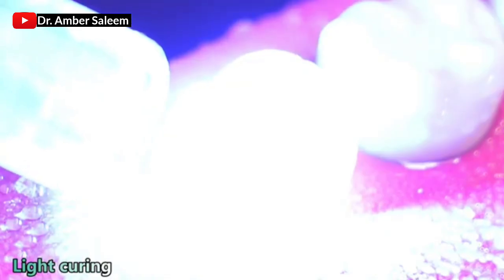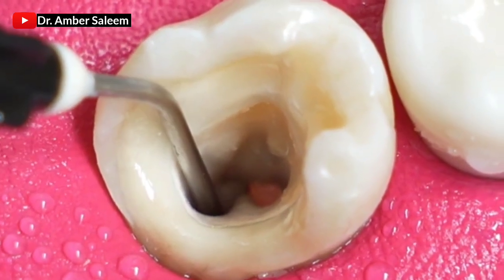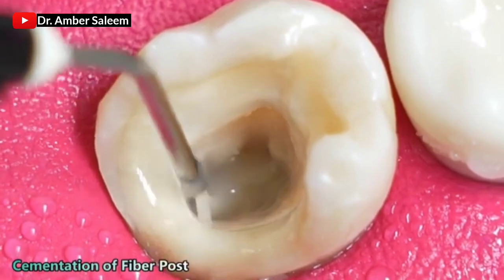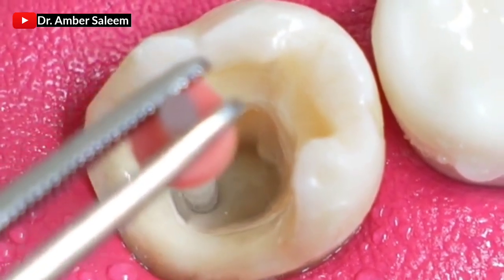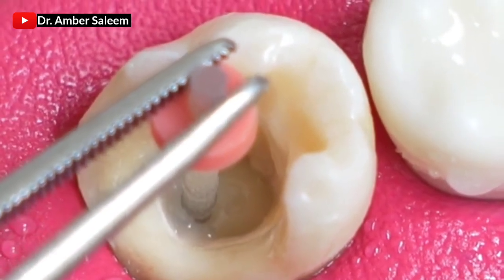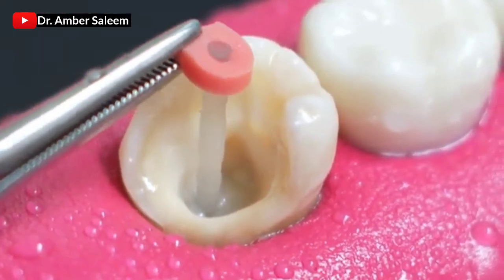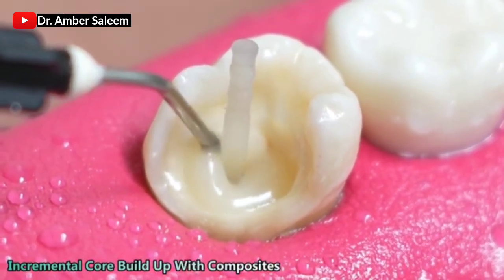Light curing. Cementation of fiber post. Incremental core build-up with composites.